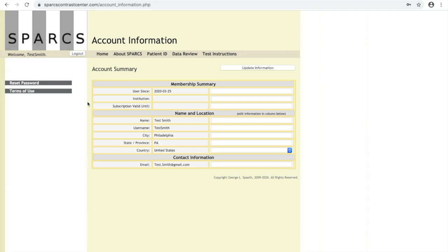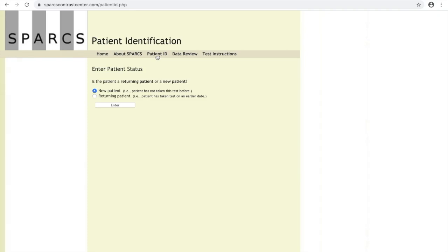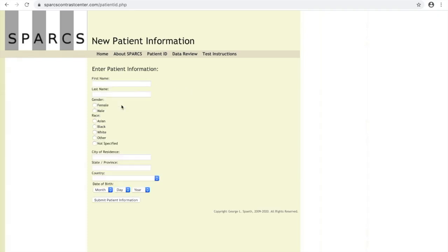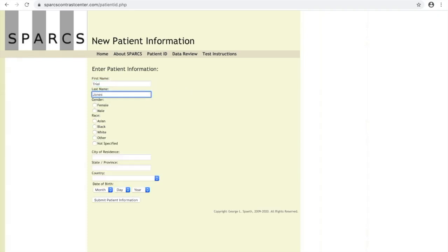Enroll your patient in SPARCS by clicking the Patient ID button and then click New Patient. Fill out their information and then click Submit.